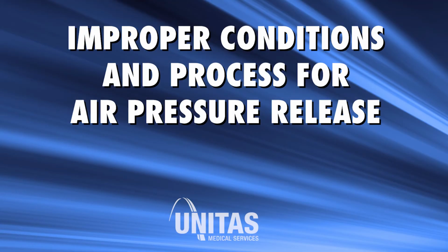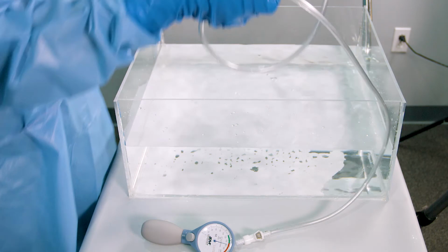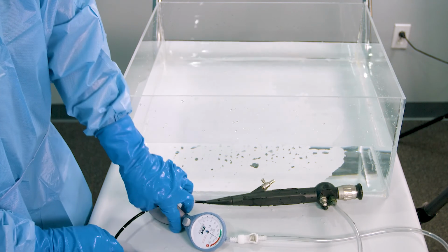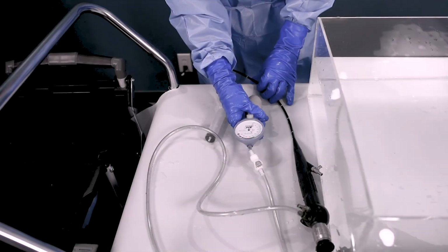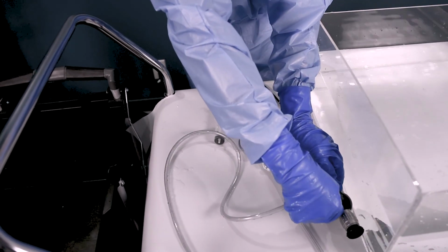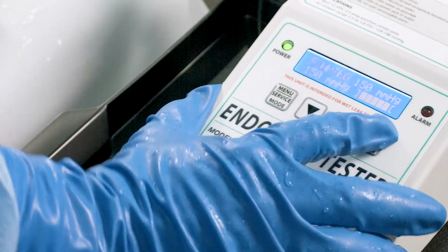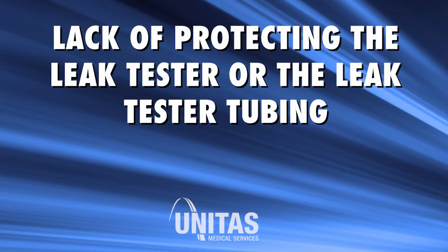Improper conditions and process for air pressure release. Once the endoscope has passed leak test and the technician is ready to end the test, the endoscope should always be entirely removed from the water prior to the release of air pressure. There is risk that the non-leaking endoscope will take on fluid from the leak tester tubing connection, and that the endoscope with an undetected leak will take on more fluid with the force of the pressure release. Confirm if your leak tester has automated or manual air pressure release. Sufficient time should be allowed for the pressurized air to be expelled. Reprocessing endoscopes with trapped air may cause damage.